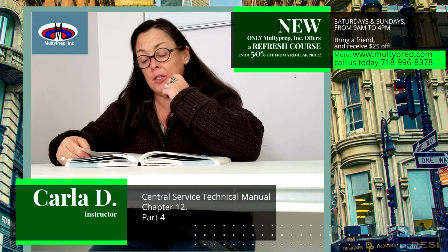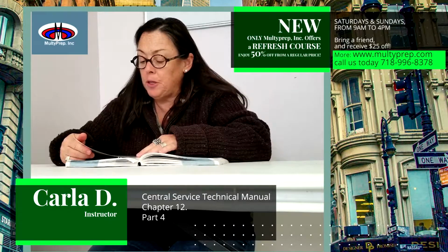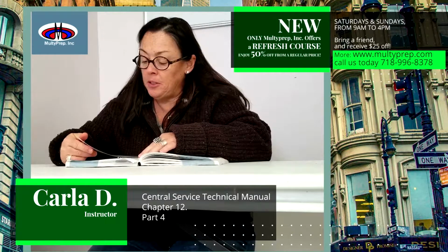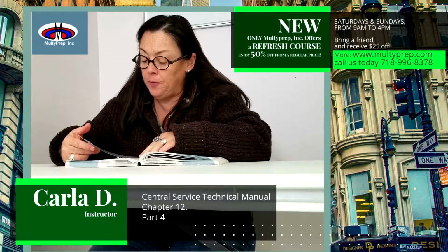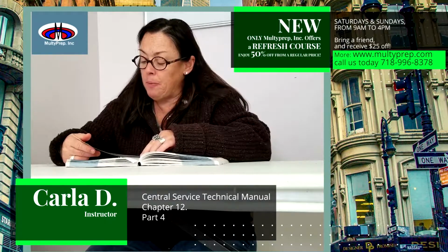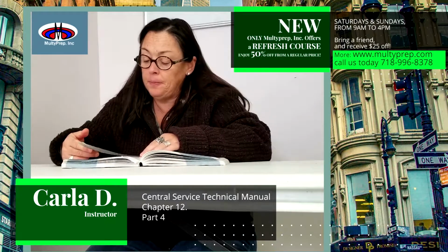Rigid container systems. Rigid container systems are box-like structures with a sealable and removable lid. They are made of anodized aluminum, stainless steel, plastic, or a combination of these materials. Rigid containers have lids and filters that allow sterilant penetration while providing a microbial barrier. Filters may be disposable, a synthetic spun-bound product, or reusable with ceramic filters or a valve system.